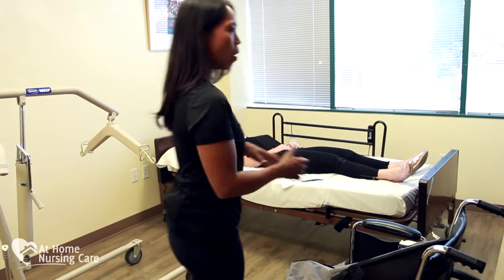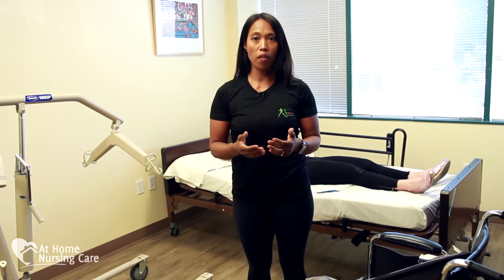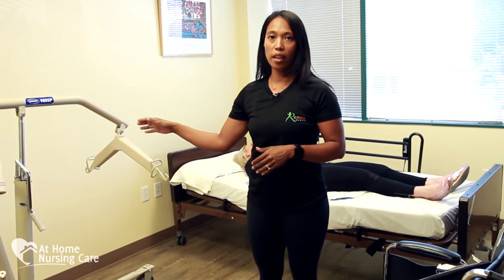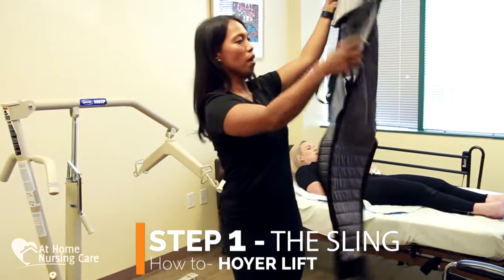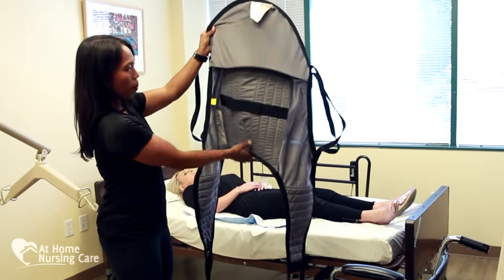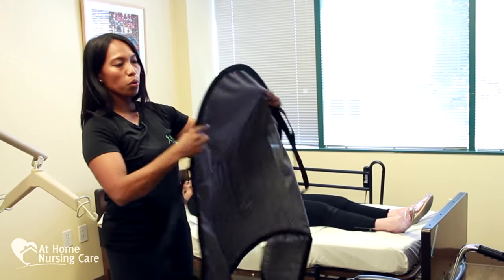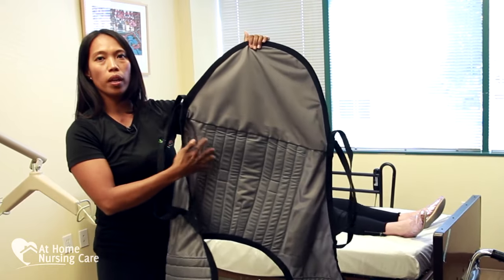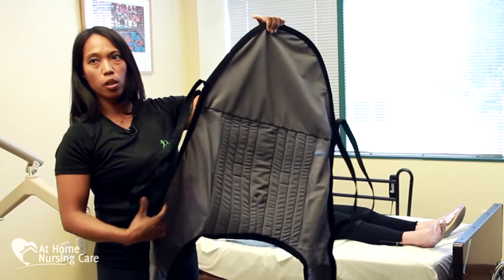Before we get started on the demonstration of using the Hoyer Lift, it's really important to understand the equipment. Creating a non-stressful environment for your client is really important because a lot of people do get nervous hanging in the sling. So first, let's talk about the sling itself. There are different kinds of slings. You'll see there's a label on here — this is a U-shape — and the smoother part of the sling is usually where it goes against the client's skin.